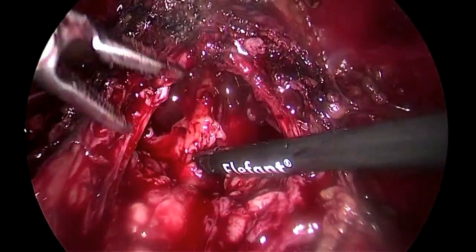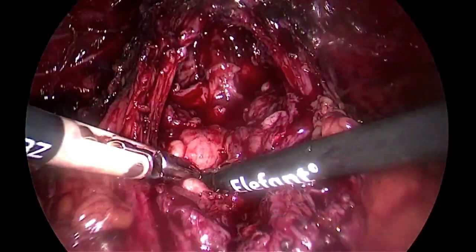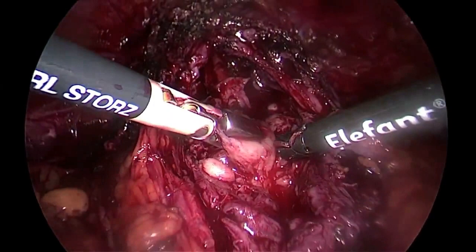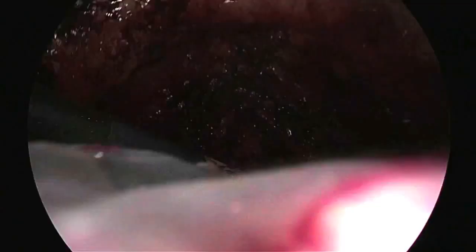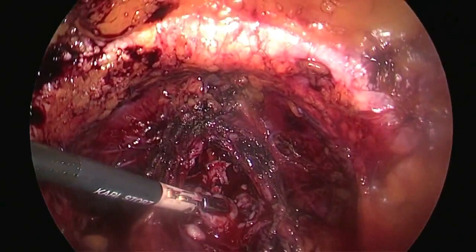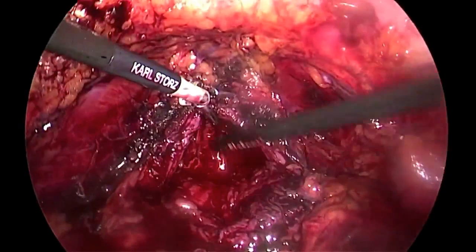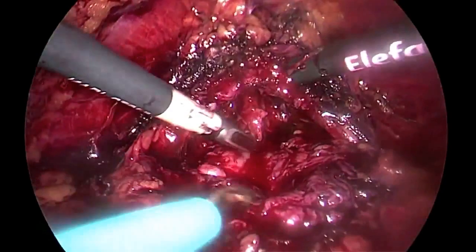Okay. Now I try to remove some nodes that are here, in order to perfect my enucleation. Can you give me the scissor, please? After I try, I have difficulties to enter with this one. Okay, scissor again. Perfect. Coagula, please. Scissor, please, again. Okay, sorry for that.